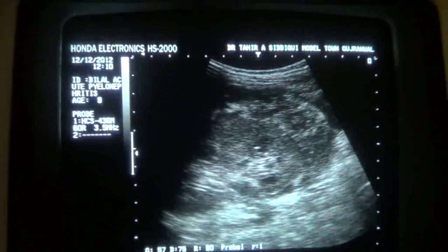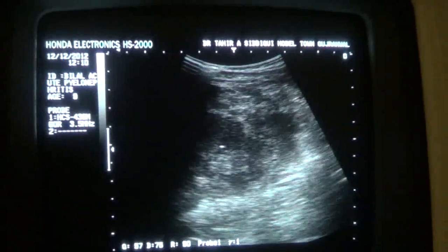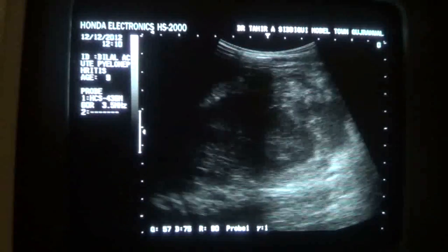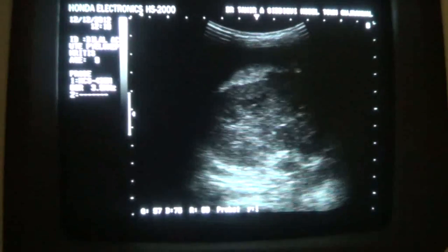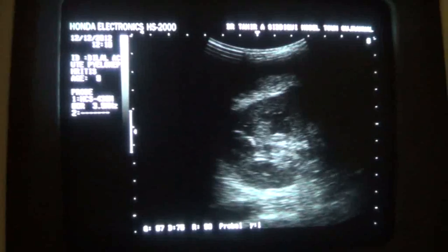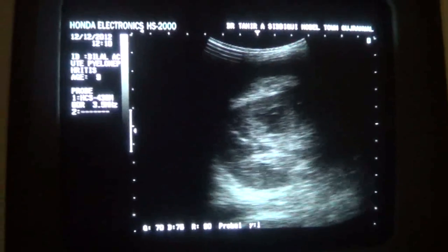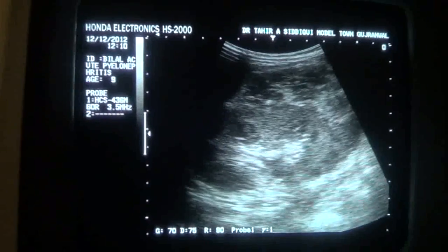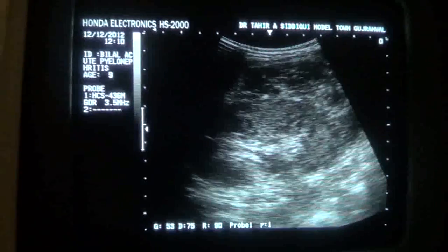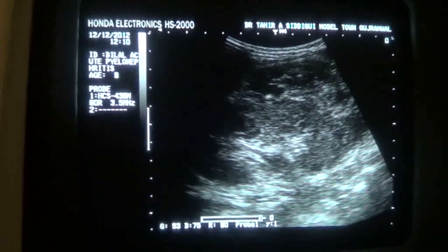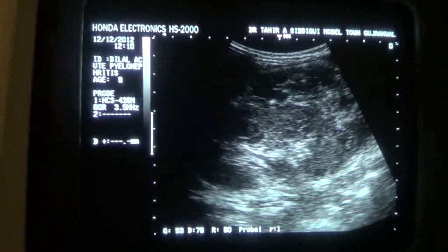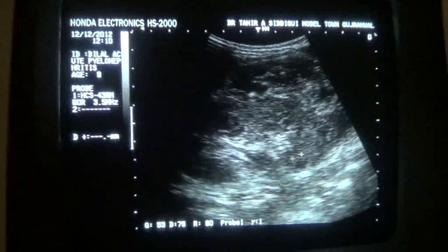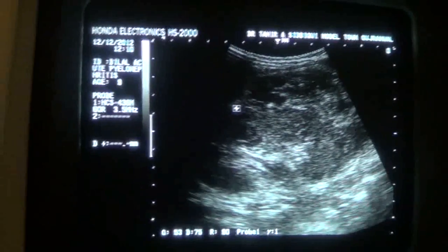Moreover, this is the lower pole of the left kidney. We can see the upper pole, mid region, and lower pole. You can see that the echogenicity of the cortex is raised as compared to that of normal.